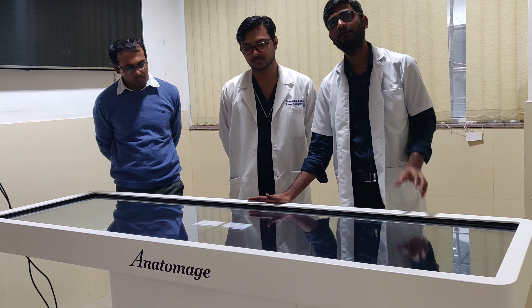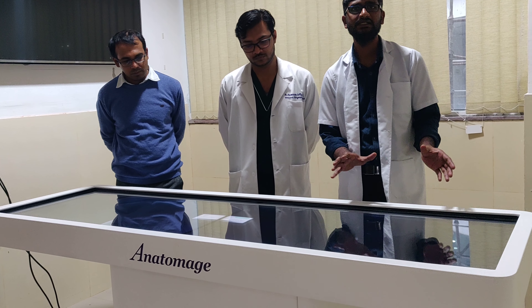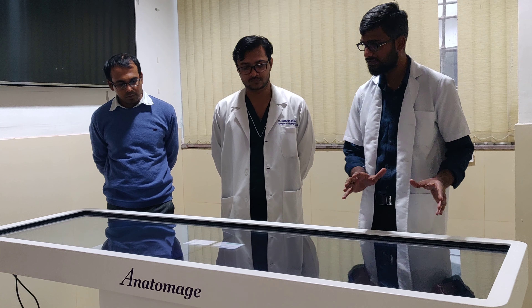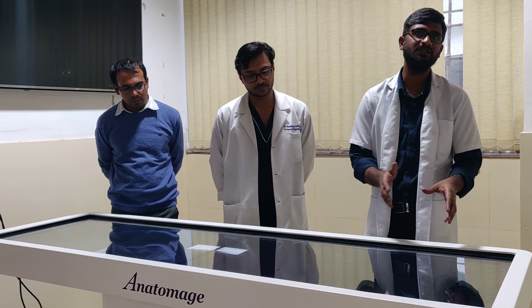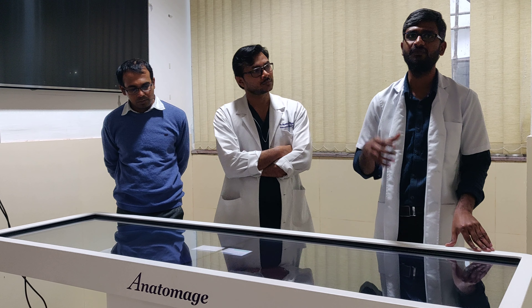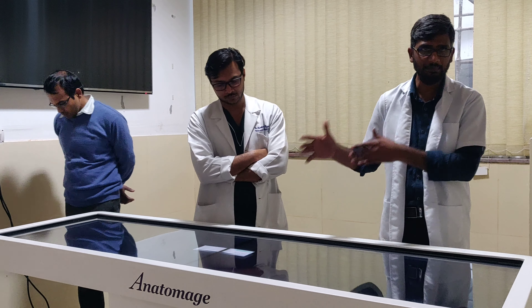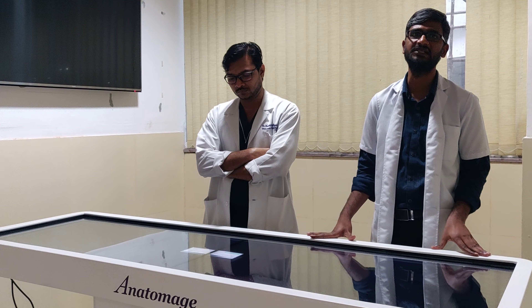The CT and MRI we convert into 3D reconstruction. With 3D reconstruction, we can do pre-planned surgery with this Anatomage table. Pre-surgery, whatever planning we need to do — we can guide, we can slice, we can measure anything. Whatever you want to do for pre-planned surgery, we can do everything with this Anatomage table.